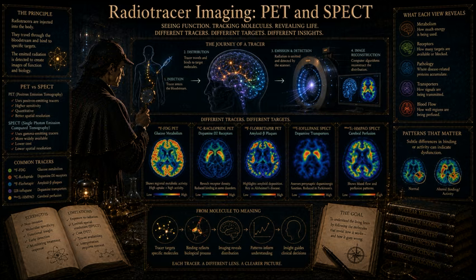It is true antimatter. When this positron is ejected from the atomic nucleus, it possesses kinetic energy. It shoots out and travels a very short distance through the surrounding brain tissue, usually just a millimeter or two. As it travels, it bounces off other atoms, losing its kinetic energy in a matter of nanoseconds. Once it slows down sufficiently, it encounters a regular electron in the patient's biological tissue. And this is where the science fiction becomes reality. So it's like antimatter hitting matter: the positron hits an electron, they annihilate, and shoot out two photons in perfectly opposite directions. That is the famous annihilation reaction, yes.